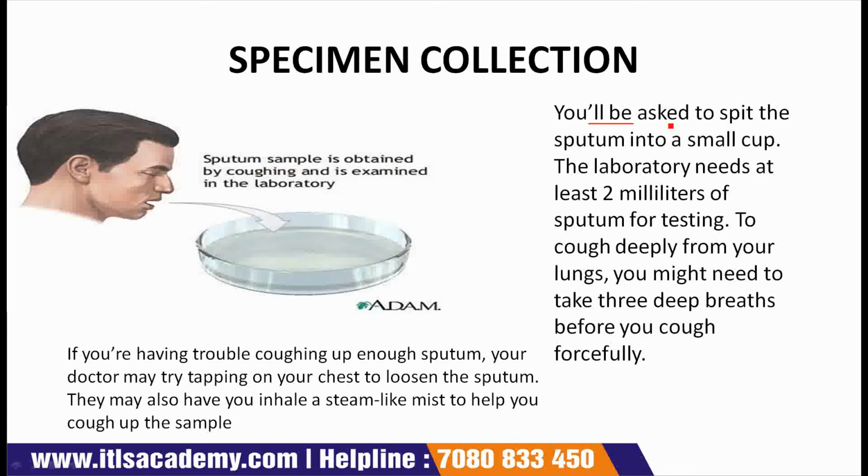You will be asked to spit the sputum into a small cup. The laboratory needs at least 2 milliliters of sputum for testing.